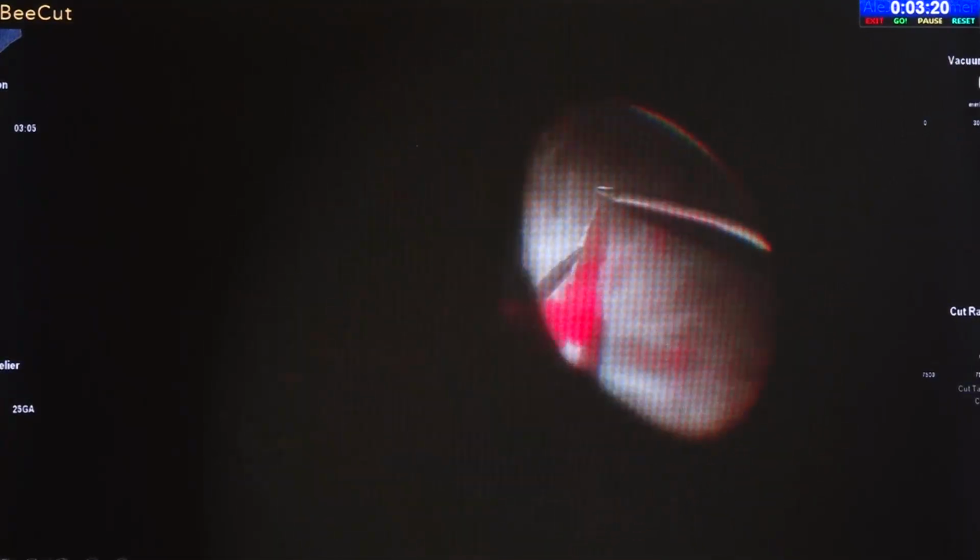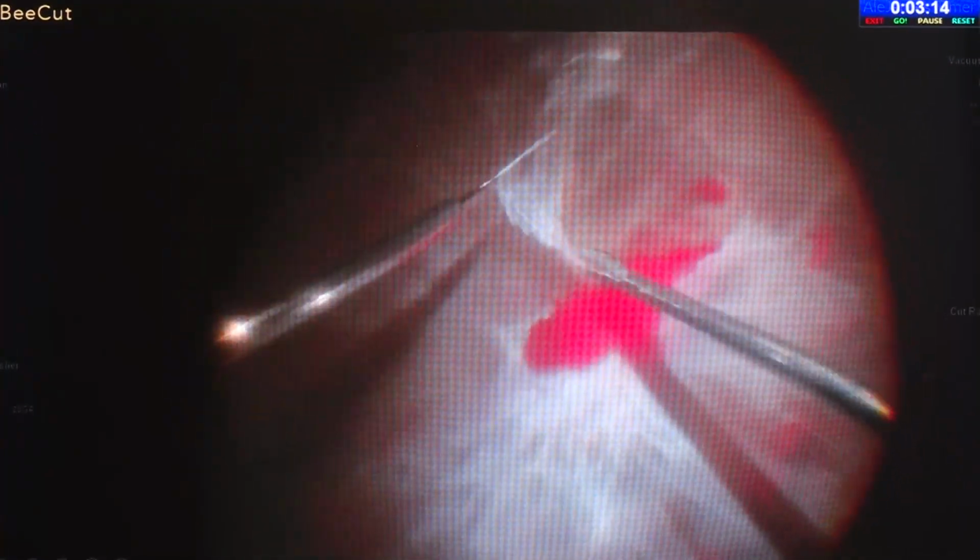to the retina. So in this situation, I also start from center to periphery, but instead of pulling the membrane, I use either an MVR blade to create a nick in the membrane, and then you can use the scissors to create the plane there. And then afterwards you can either do unimanual or bimanual, but this vitreous which is adherent to the retina all around needs to be removed.